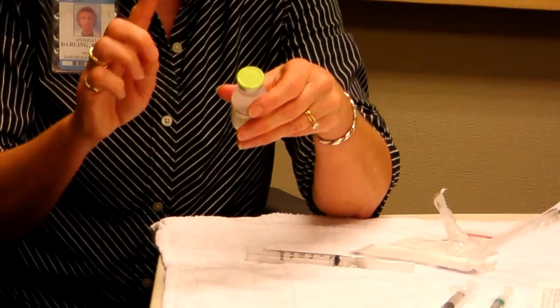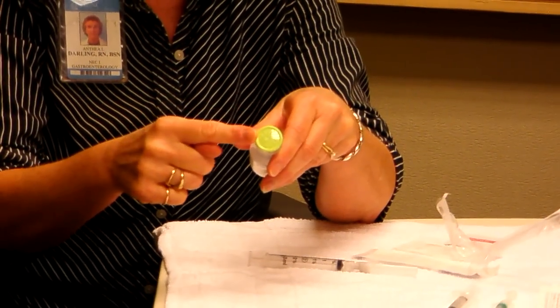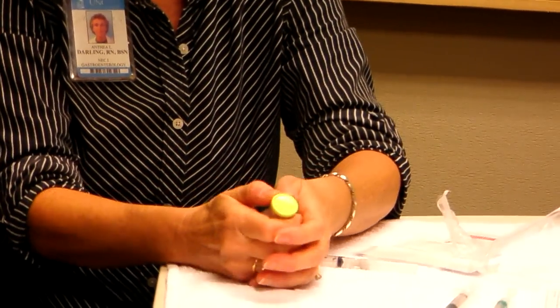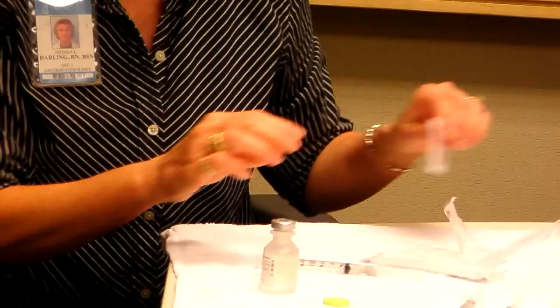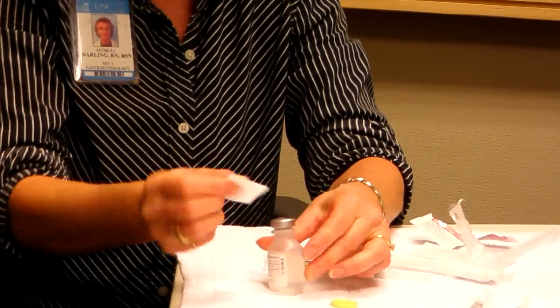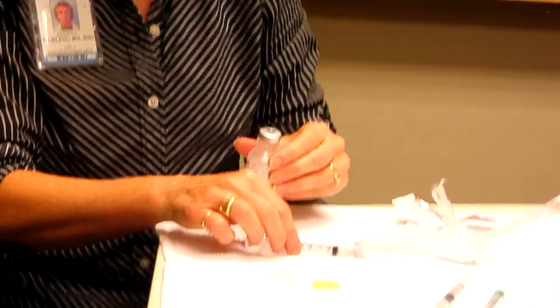The first time you open a bottle, it's going to have one of these plastic pop tops on them, if you will. You just pop the top. It's clean underneath. Take your alcohol swab, wipe off. There's a rubber stopper underneath there that keeps the liquid from coming out.